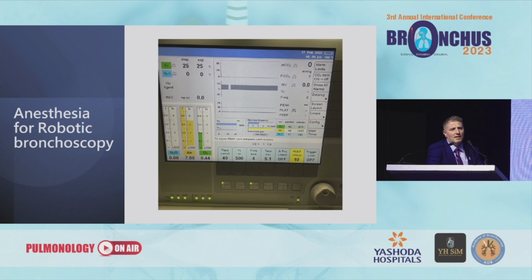Very important, as highlighted multiple times, to have an idea about what to tell the anesthesia and connect with them before the procedure. You don't want to do all those steps and then the anesthesia doesn't know what you are planning to do.